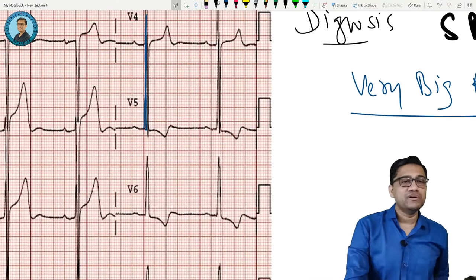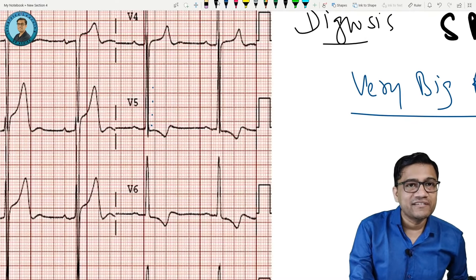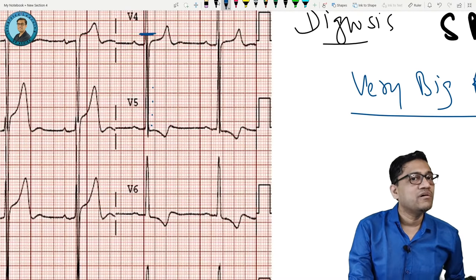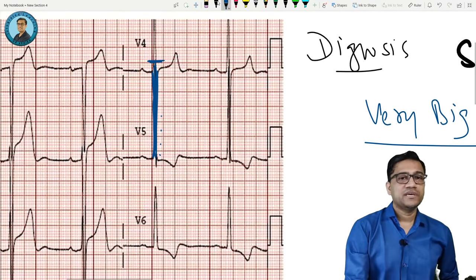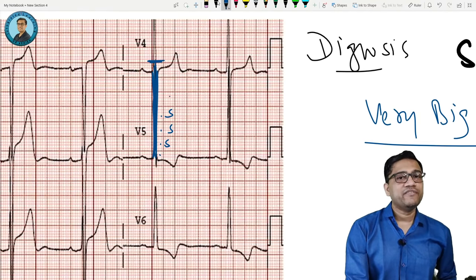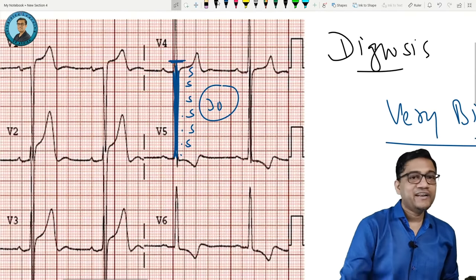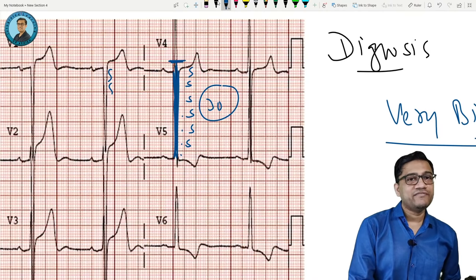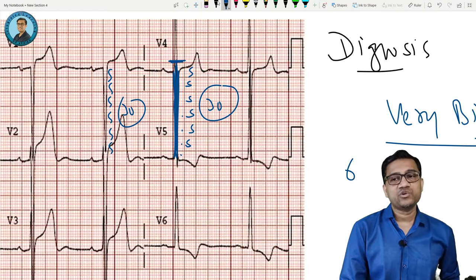If you try to count, how will you do it? 5, 5, 5, 5, I don't even know where it's ending, okay? I think till here, yes or no? So, how many boxes? 5, 5, 5, 5, 5, each is one, no? So 5, 5, 5, 5, 5, 5, 30. Are you clear? 30 are this, okay? And this is again 5, 5, 5, 5, 5, again I think 30. So total 60, yes or no?